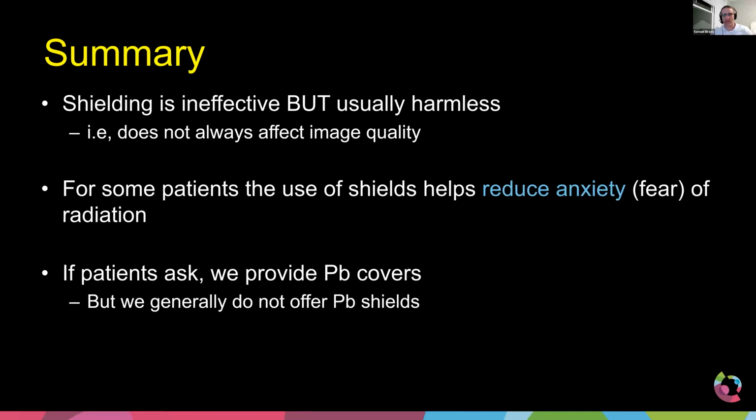The technology we have now is so good. It really does reduce the dose. Now, I know there are places in this world, and I know there are places here in the US, that just can't afford fancy new CT scanners. They're using scanners from 10, maybe even 15 years ago. It's hard to believe, but that's just what they've got. You can still do stuff with those types of scanners. You can still reduce the dose. You're limited, you definitely are. But if you replace scanners in your hospital every 10 years or so, you're going to have new technology to do amazing things to reduce the dose to our patients.